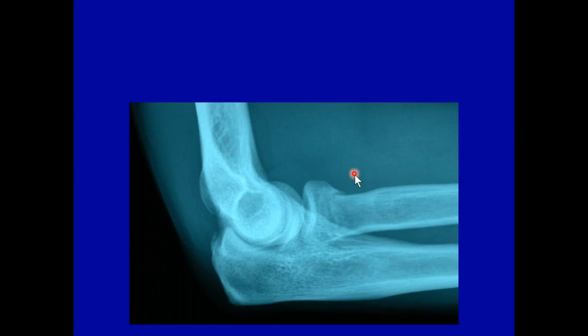Now, your responsibility isn't over, because if this is the patient in your office, at what point does the fracture heal? So 4 to 6 weeks later, on average, we're going to do a follow-up examination. If your lateral examination was well done, like this is, then the follow-up examination shouldn't be any different.